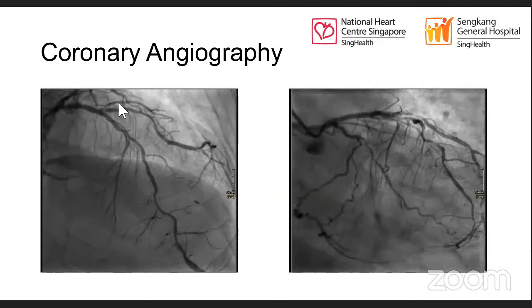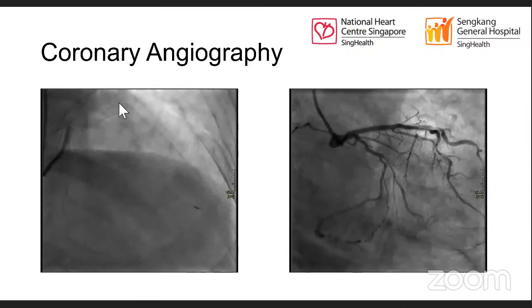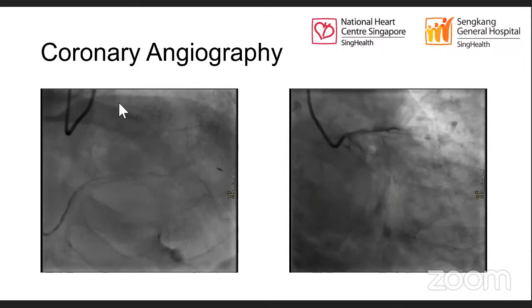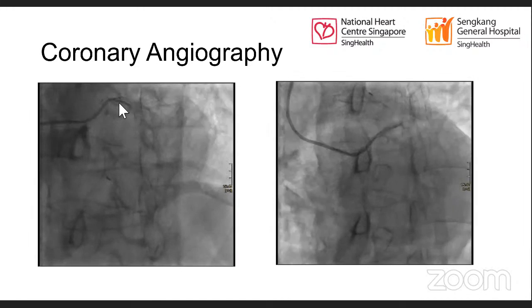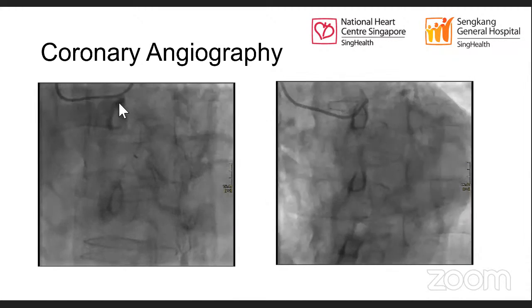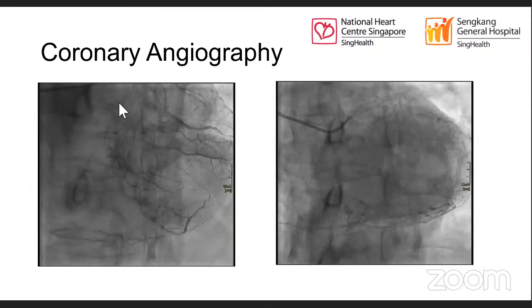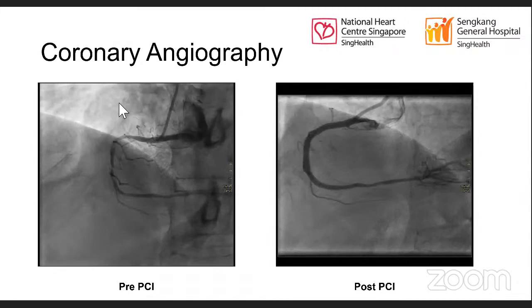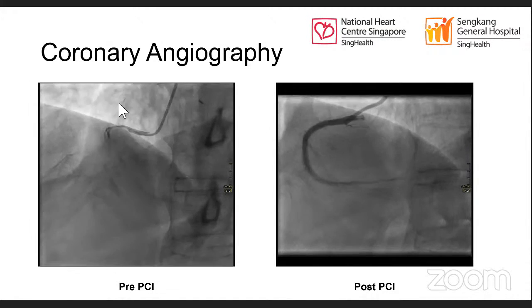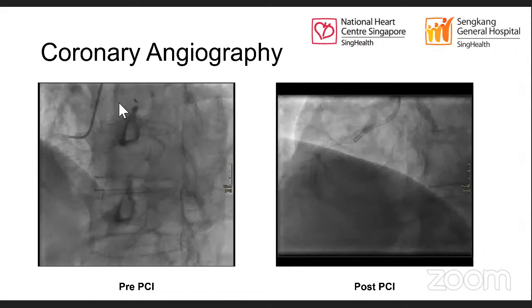Now we go through the angiography of the left coronaries. There's diffuse LAD disease. Next slide. These are the RAO caudal and LAO caudal views. Next slide. The right coronary was what was done the last time, stented from proximal all the way to the distal RCA. Next.